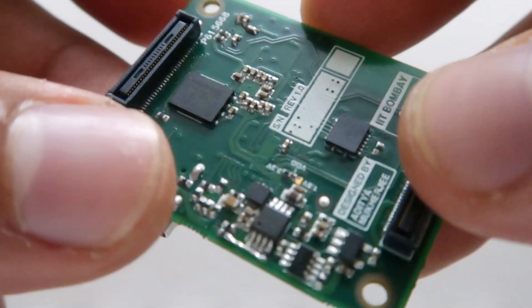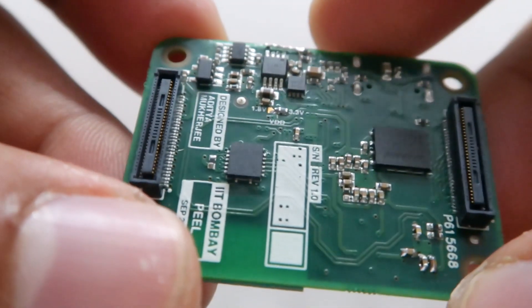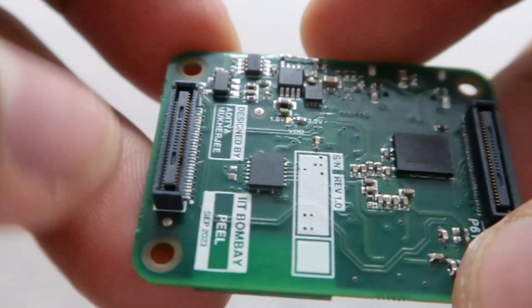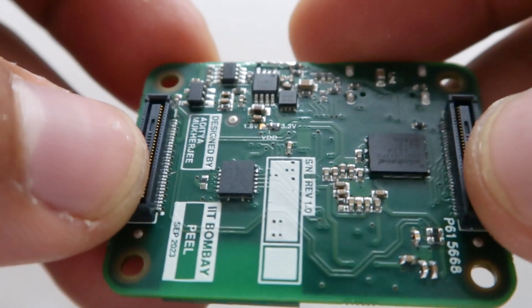If you turn it to the other side, you're going to find some more battery management ICs and power management ICs, as well as two DF40 connectors with three millimeter stacking height.